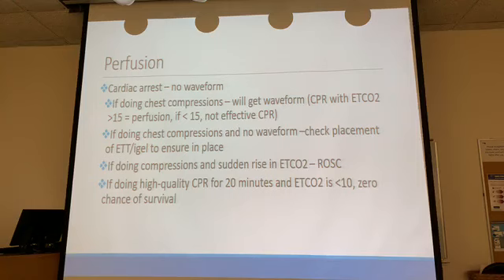And then the one thing that's been shown in multiple studies: if you've been doing high-quality CPR with an end-tidal CO2 of 15 with your efforts, you've been doing this for 20 minutes, and when you stop, your end-tidal CO2 drops to less than 10, there's basically a 0 chance that patient is going to survive. So, something to keep in mind.